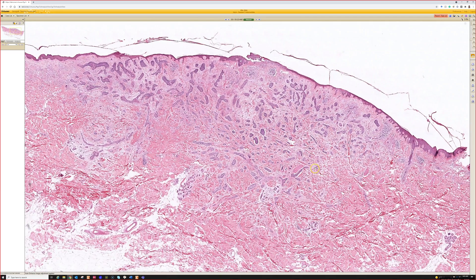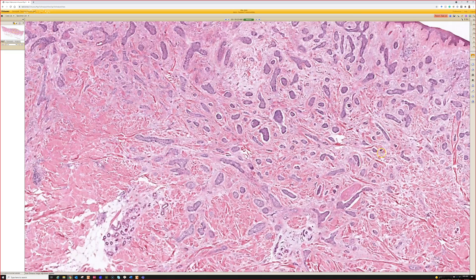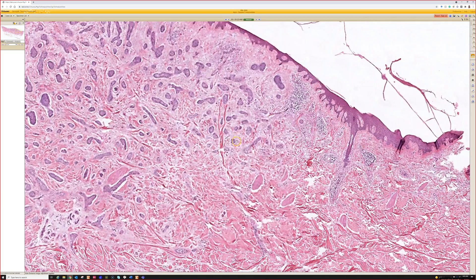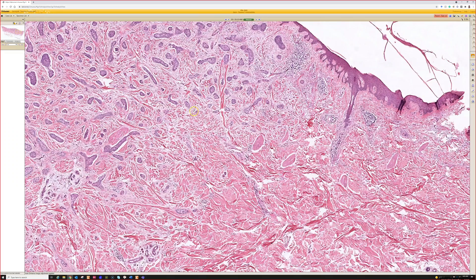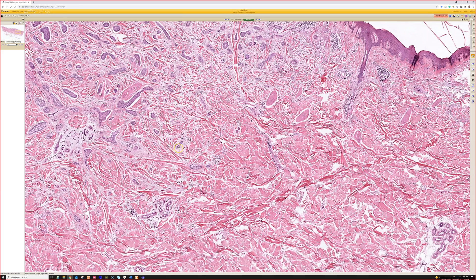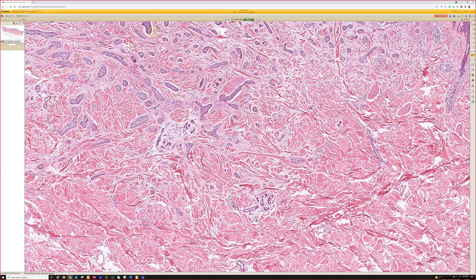This is a nice example of infiltrative basal cell carcinoma. You could call this micronodular because it has little tiny round islands. For micronodular, I want more than just tiny islands — I want them to be trickling out into the dermis away from the main tumor. That's what I look for: getting way out here, trickling along.